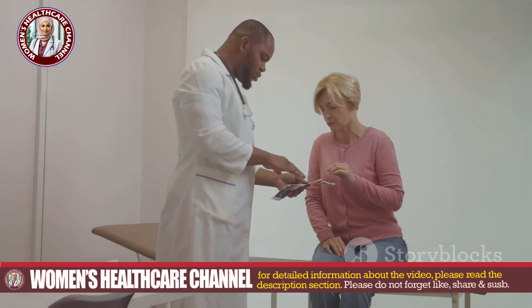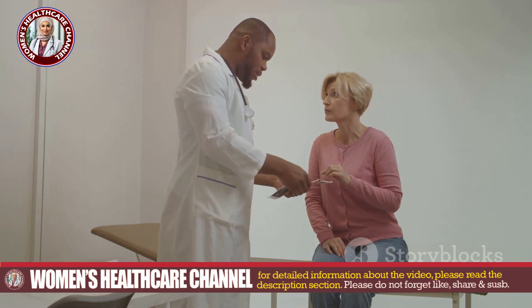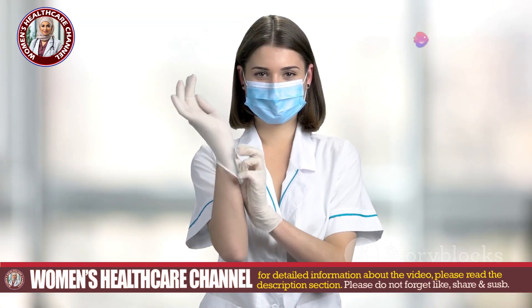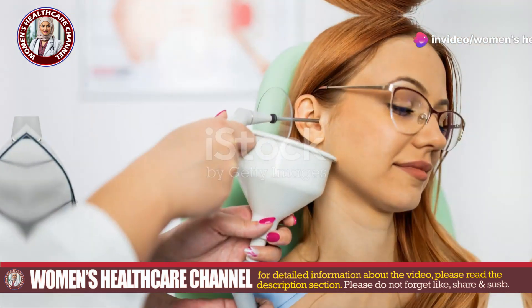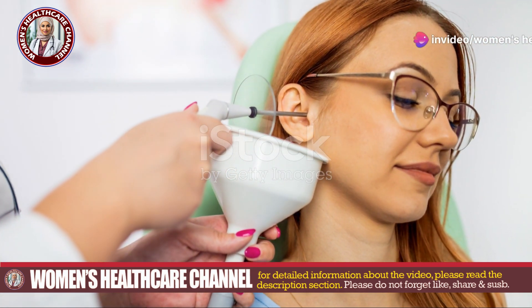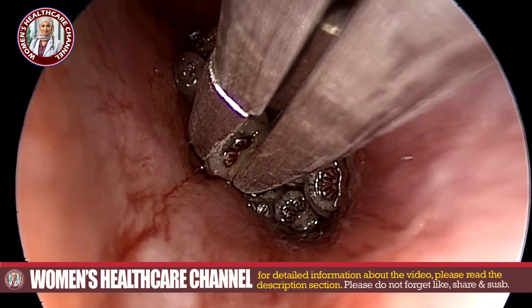Preparation is key. Ensure a well-lit, sterile environment and explain the procedure to the patient to reduce anxiety. Wash your hands thoroughly and wear sterile gloves. Use an otoscope to assess the extent of the infestation and identify the number and location of the maggots within the ear canal.